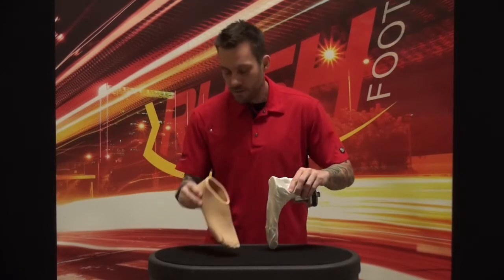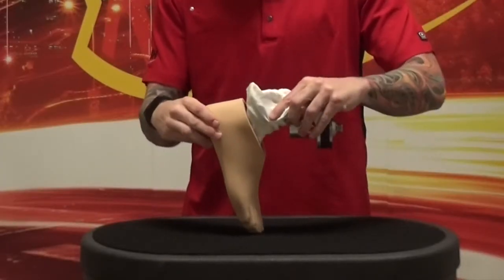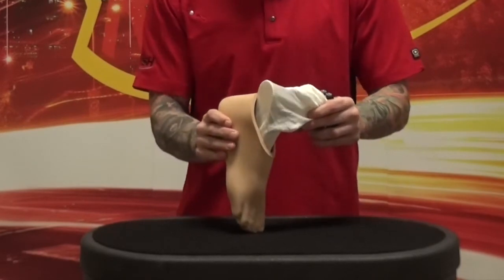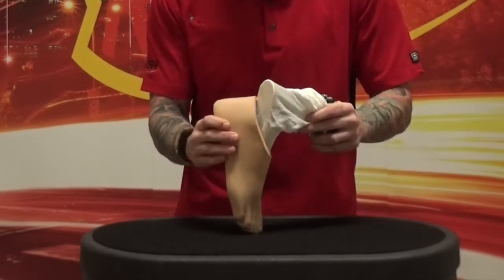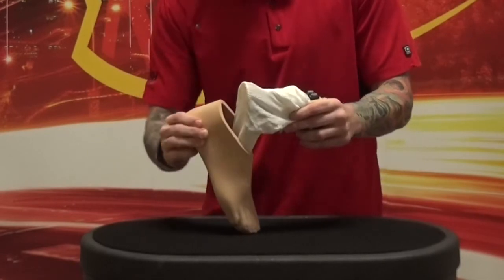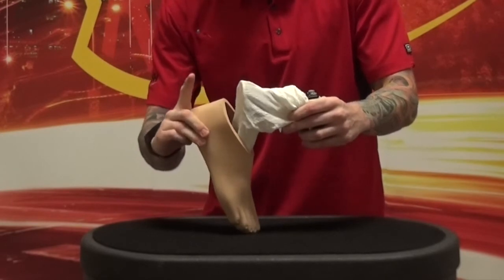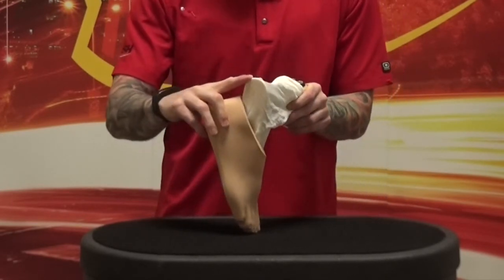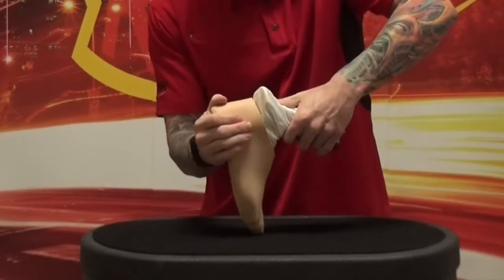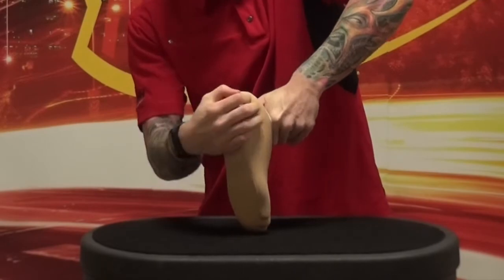So you see here, I'm going to put this toes down and slide the toe section in, and then I'm actually going to turn both the foot and the foot shell in towards me as I press down. At the same time, I'm going to be squeezing the heel. You notice that as I squeeze that heel, this trim line is going to sort of rise up, and that'll let me get it up over this round part and slide it in place, just like this. Toes down, turn them in, squeeze, push and wiggle.